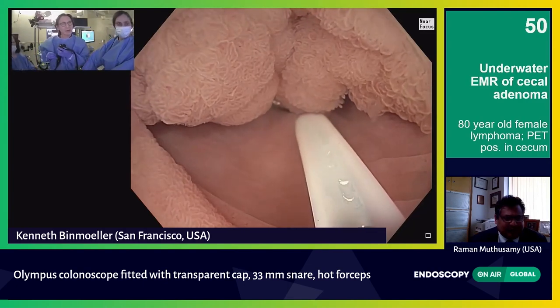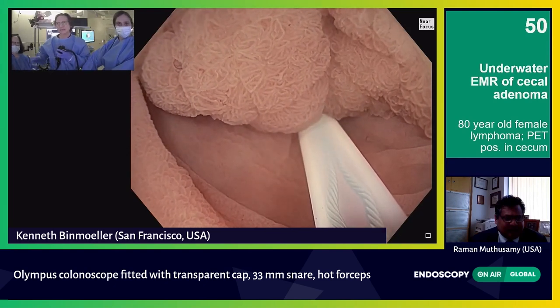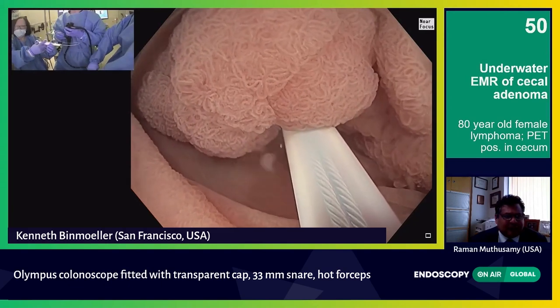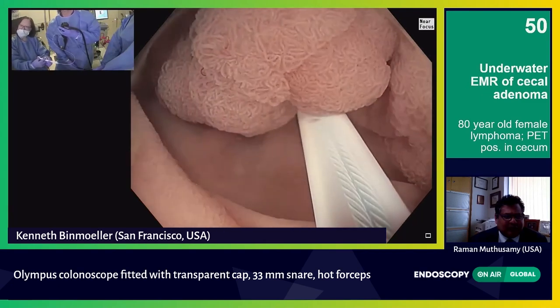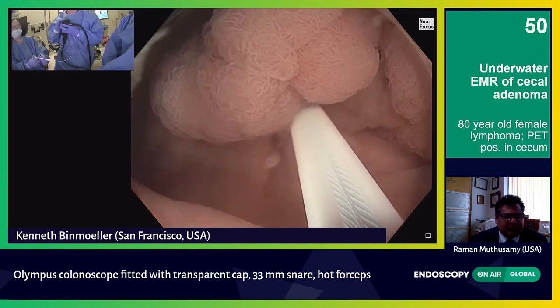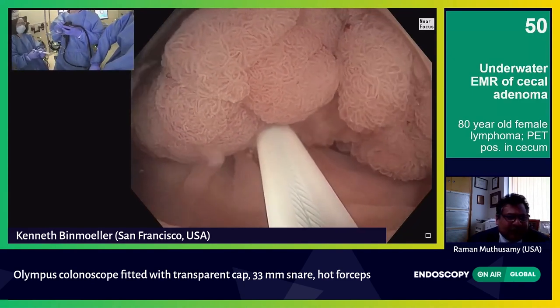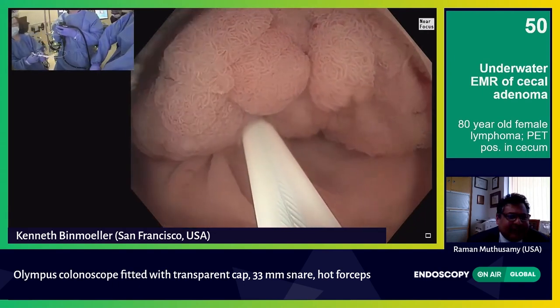Now, what you can do is just start to close. Jeannie's closing now. What I'm doing now is I'm strangulating off the blood supply. I'm looking for discoloration — that's an indirect way of assessing whether I have the entire lesion or not. If there's part of it that looks whitish, more pale, then I didn't get that. My sense is it looks pretty violaceous already — a little reddish.